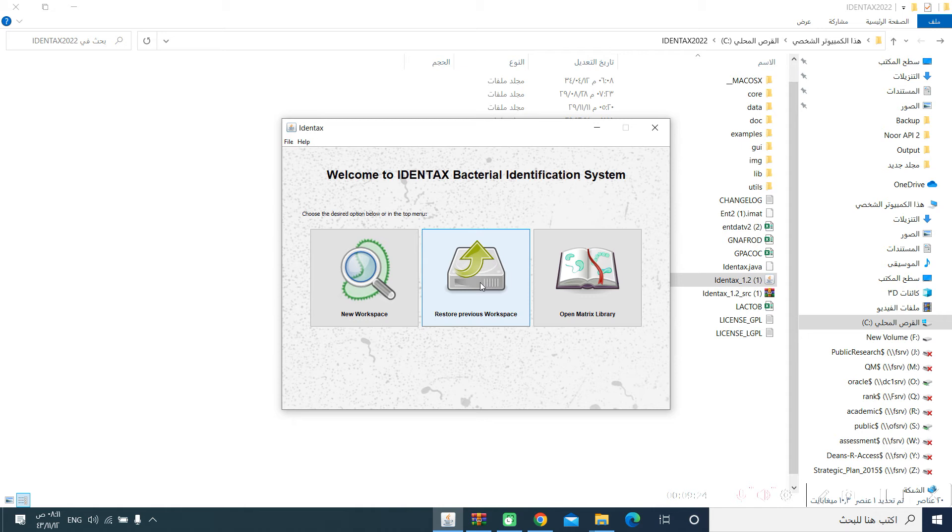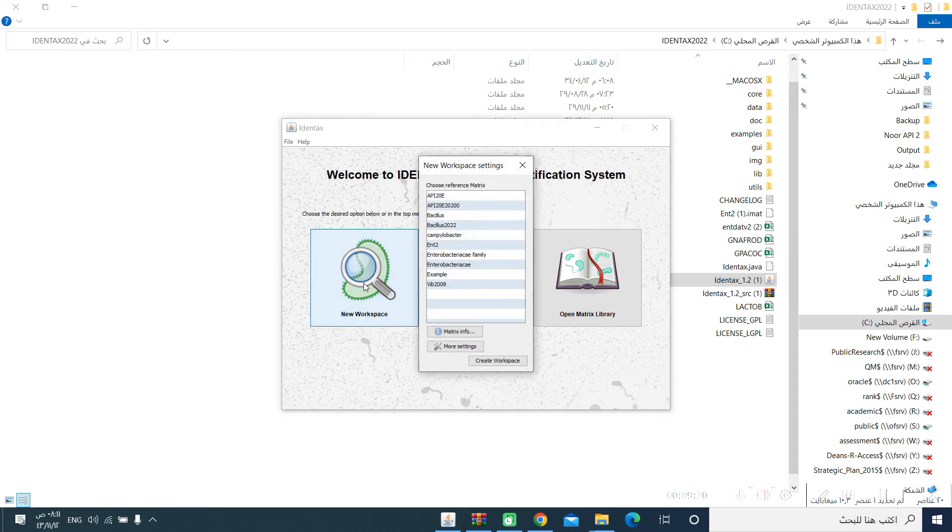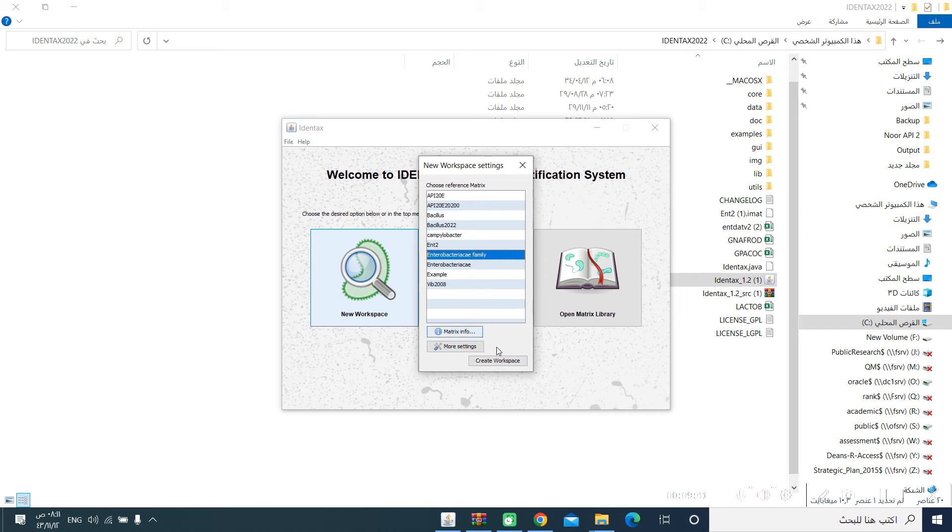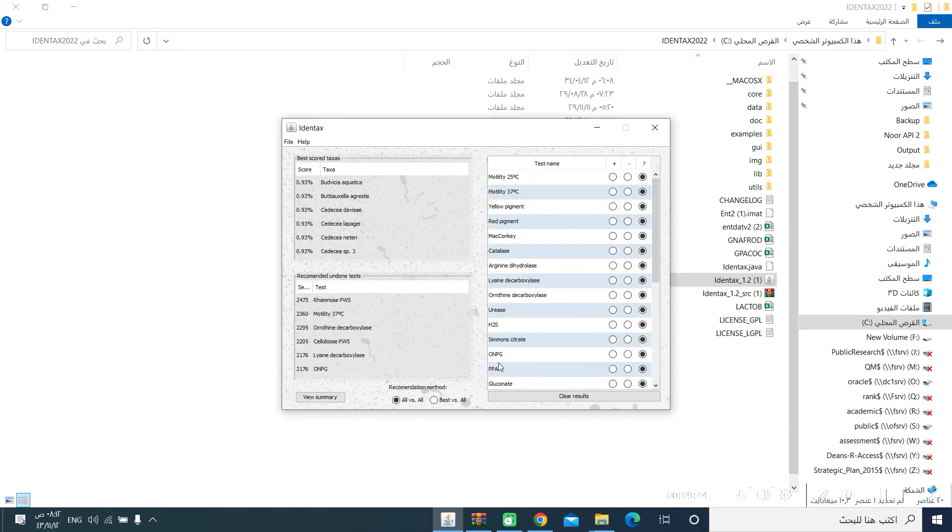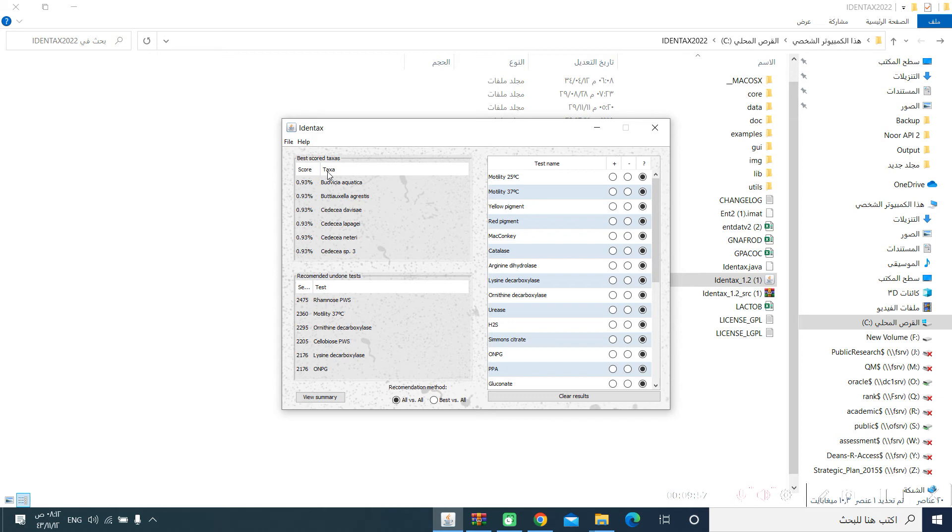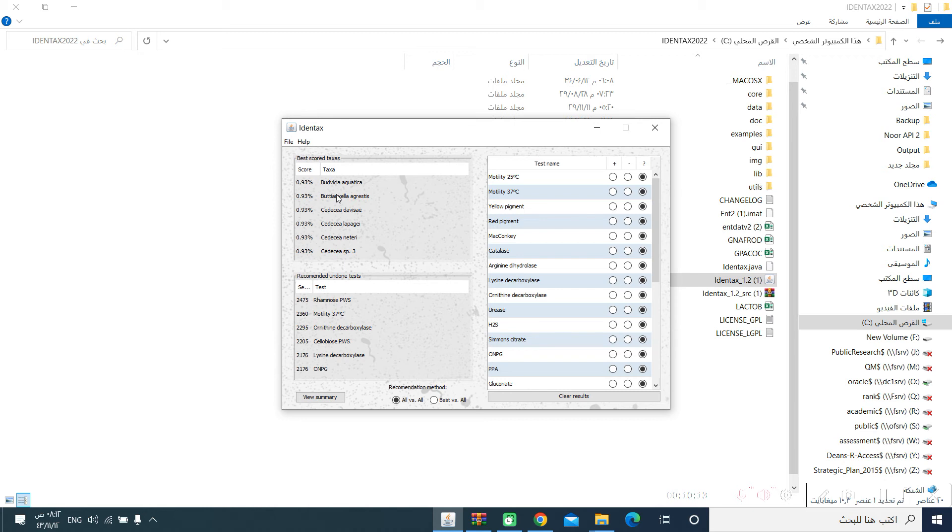If you want to use this software, you will say that we are going to have a new workspace. And you will select the matrix, and we have added the Enterobacteriaceae family. So, we will say create workspace. In this workspace, we will find three main screens or boxes. One that is used to identify the taxa, the taxon of the bacteria. And you will see a list of bacteria that are arranged based on the percentage of identity. At this moment, they are arranged alphabetically because I did not enter any of the results of the test.